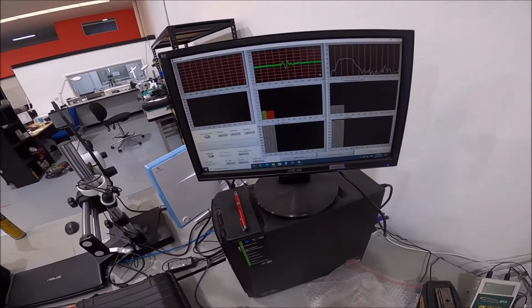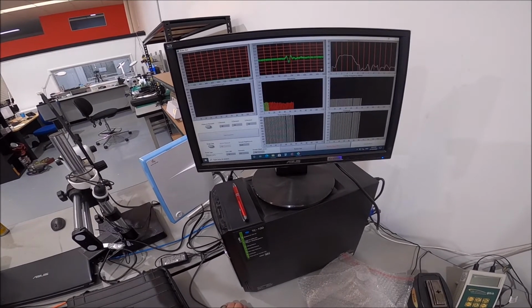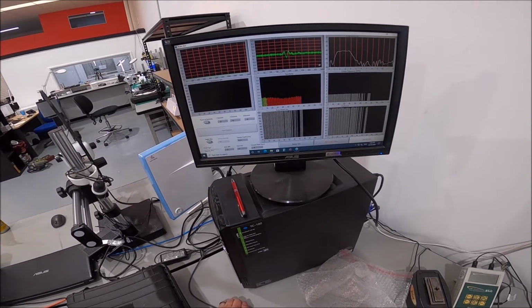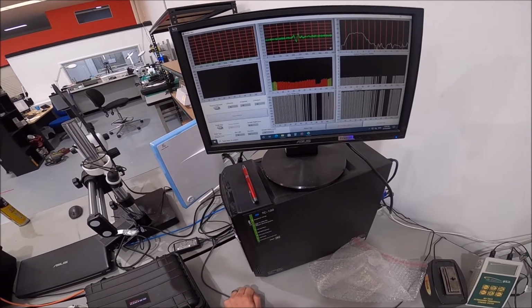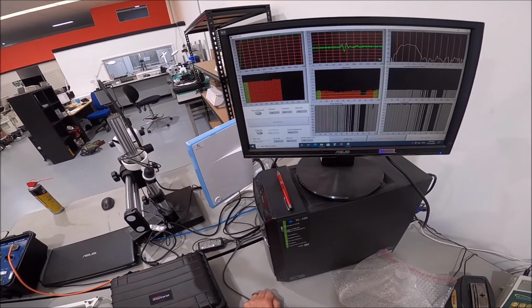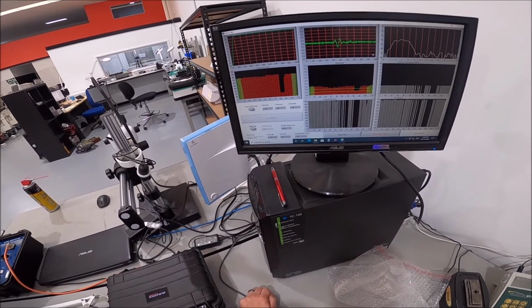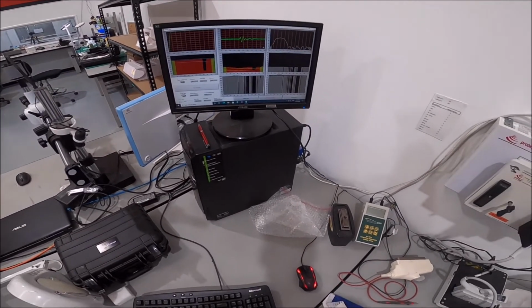and then hopefully you can see the screen here, you can see it's measuring the sensitivity first and coming up for the region that has a problem, right? So that sensitivity's dropped way off. And then we measure the capacitance. So you can see that coming along now, and there's those dead elements. So you can see it had a fault and we couldn't see it at all on the screen.